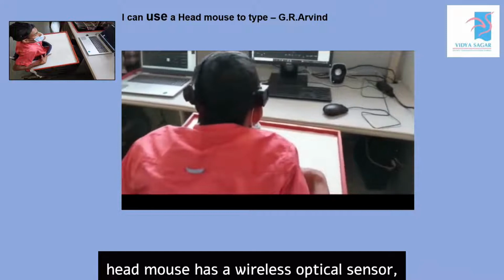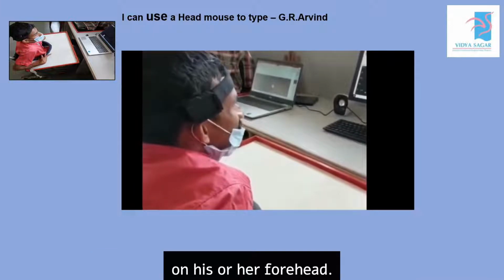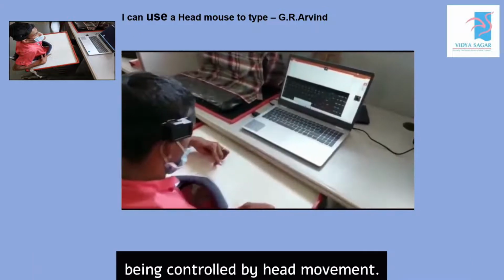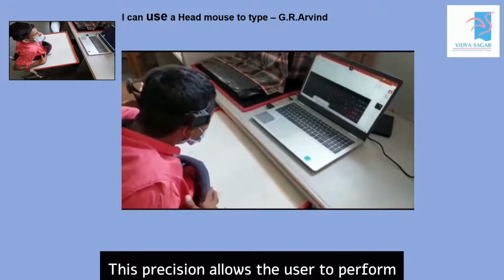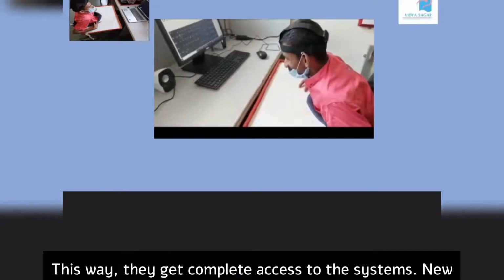The head mouse has a wireless optical sensor which tracks a tiny target worn by the user on his or her forehead. It just works like a computer mouse with the mouse pointer being controlled by head movement. This precision allows the user to perform tasks such as editing, typing, drawing, etc. This way they get complete access to the systems.